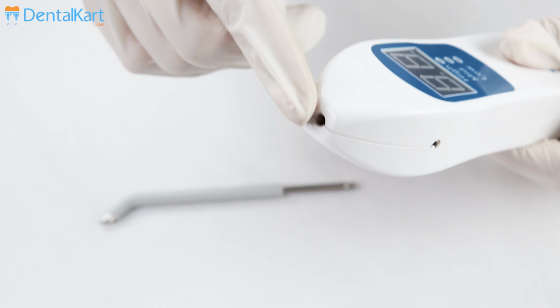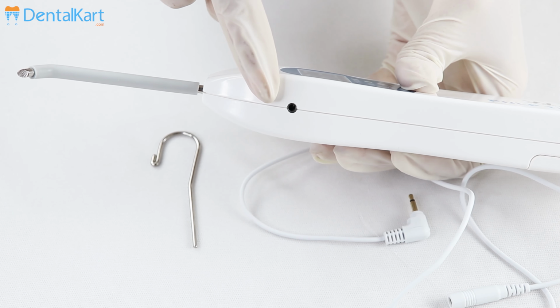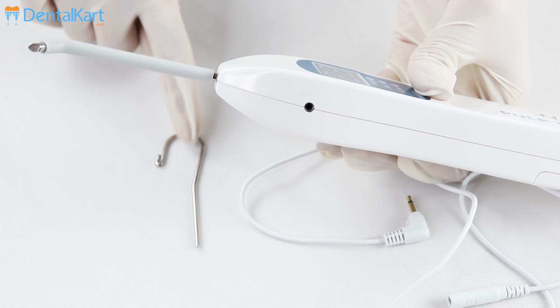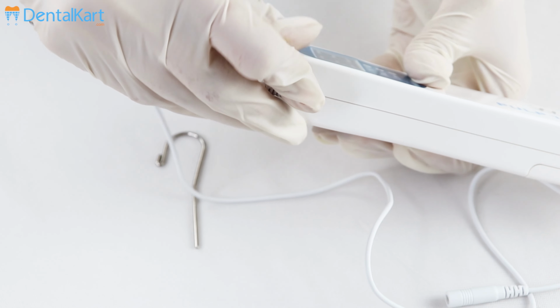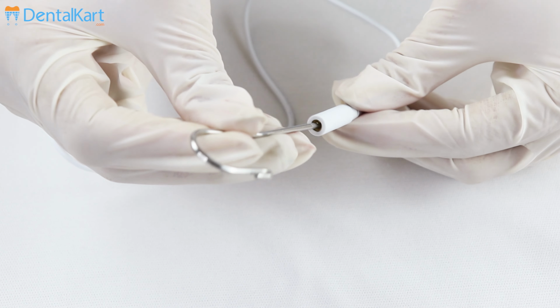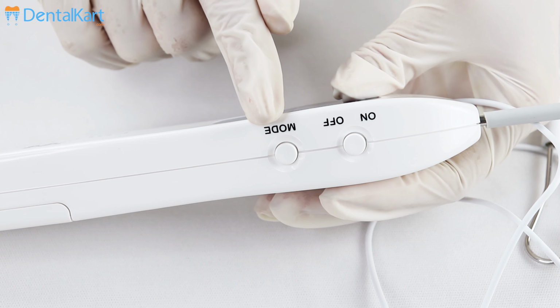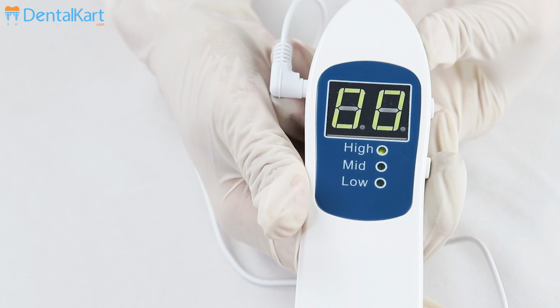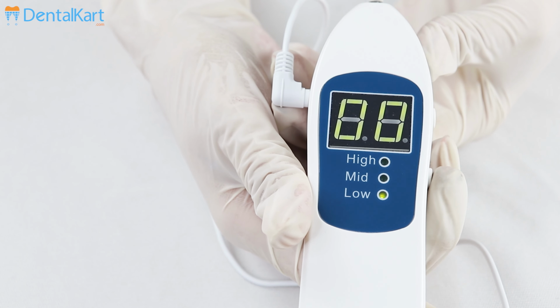On the top there is a hole for attaching the test electrode. On the right side there is a jack for attaching the test cable, where the lip clip will be connected. The power and mode button is present on the left side and the test results are visually displayed on the screen. It has 3 modes: high, medium and low.